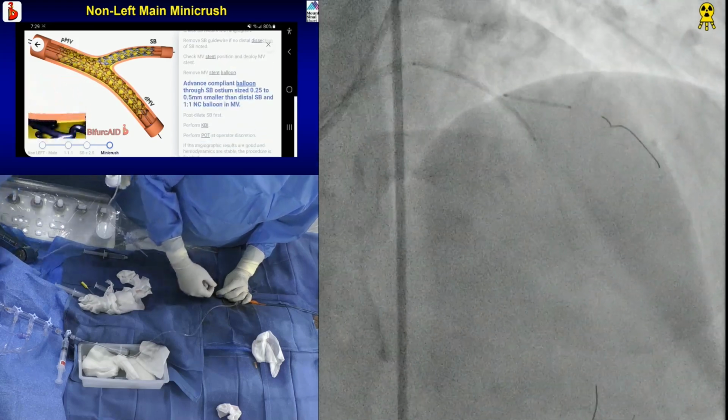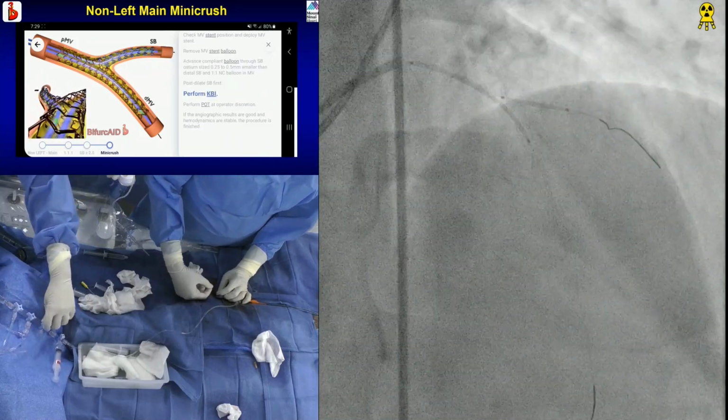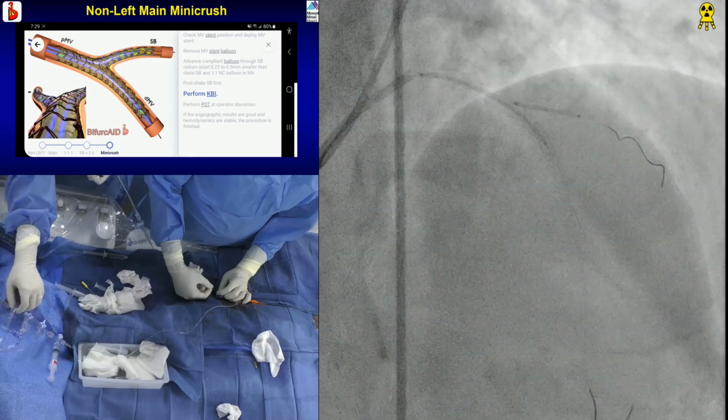That's good. Die in the left, that's good, vein. Look at that. Yeah, that's too much, too fine. Okay, I'm doing the diagonal now. Okay. Happy? Yes. Okay.